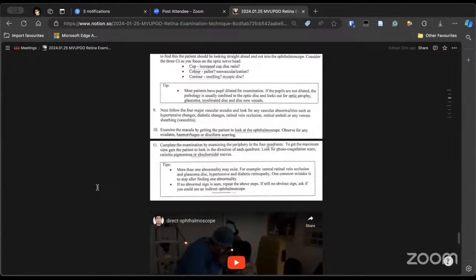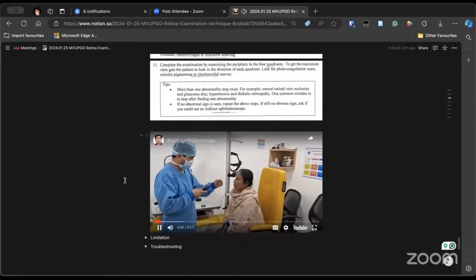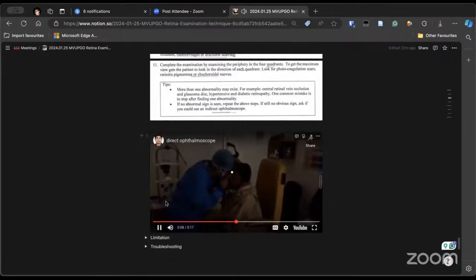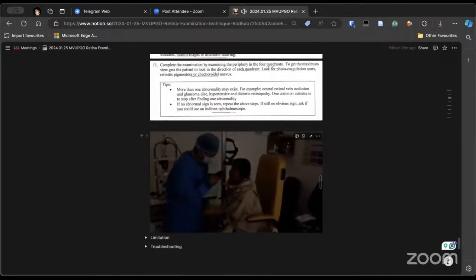And also definitely there may be multiple abnormalities which might coexist. So do not stop when you see a single thing. And whenever you are doing this, you tell the findings simultaneously. So this is what I do in clinics. This is very simple. Obviously you switch off the light and you greet the patient and sanitize your hands. Then you go near to the patient, and for the right eye, because this light is less, so the focus is less.